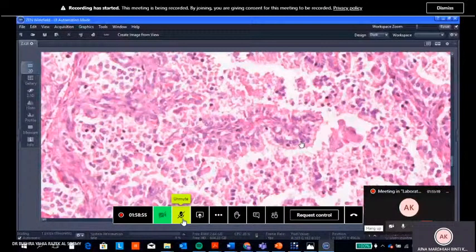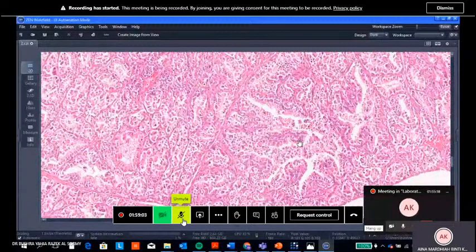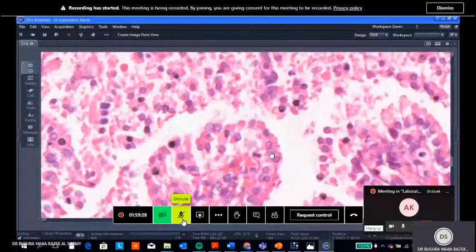Yes, so to describe, it's just a pseudo papillary pattern, with scalloping and hypervascularity for Graves' disease. For Graves' disease, the follicles are hyperplastic and lined by high columnar epithelium. Some of them are crowded and form pseudo papillae protruding to the lumen. But they don't have the nuclear features of ground glass. They are normal.